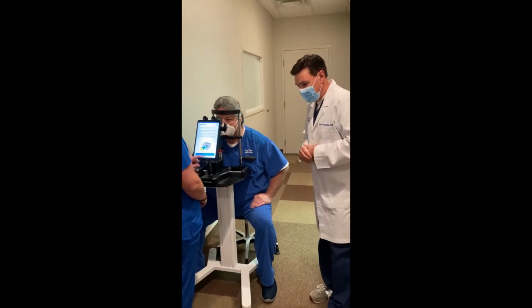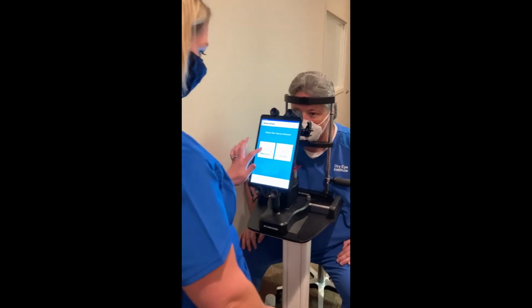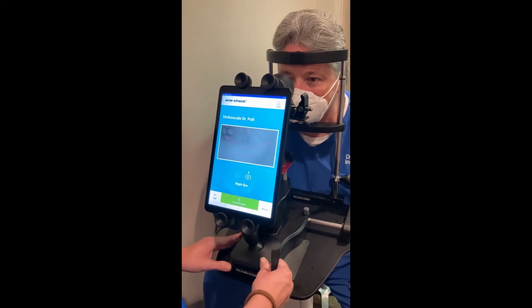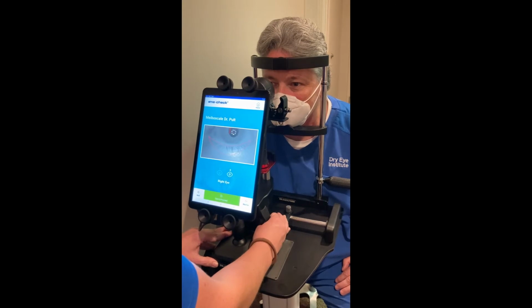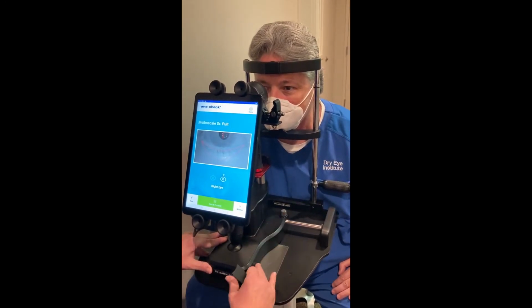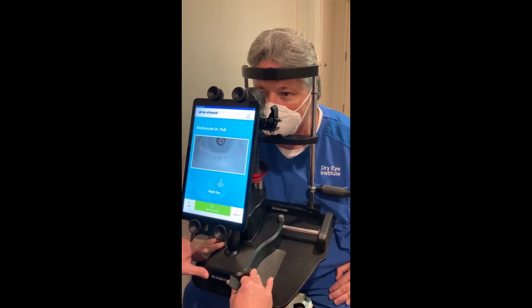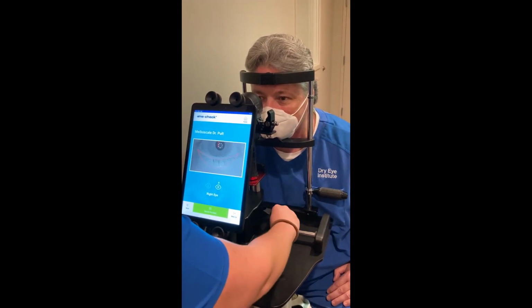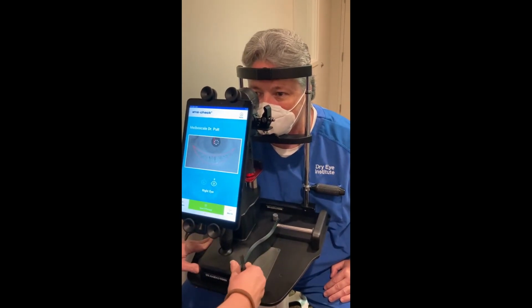All right, I have one of my technician assistants here, Stacy, who's going to take us through the process and our patient, Michael, here today. So let's select the patient, and we're going to do meibography. This is called the Meibo Scale, as we talked about. And you can see the red outline lines up beautifully with the lower eyelid in terms of where your meibomian glands would be. The lights in the pupil are typically what the patient is also seeing. That's a targeting mechanism for them to look at it, to be centered, and to look in that center area. As you look at our alignment, we also have a red light that helps us line up the pupil, or the center of the eye itself. And there's a perfect lineup for the right eye.